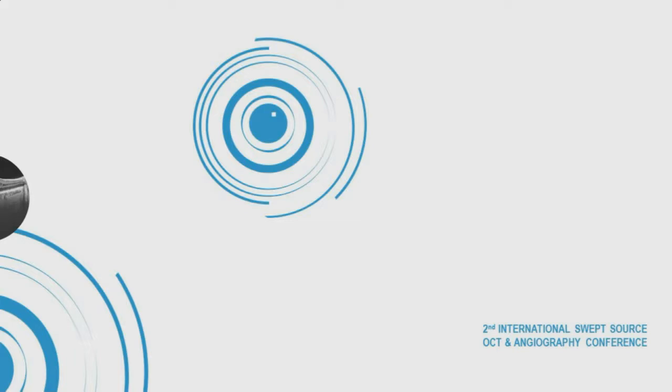Very interesting. As you showed me in New Orleans, I think, the RNFL pictures you're playing with. In glaucoma, we have a big group of patients. We reach the floor, and that's all. That's where OCT stops. What we are measuring is the thickness of the RNFL. It looks a little bit primitive now with all these pictures. Are you doing something for that? At that floor effect, can you still count some RNFL that's hiding inside the structures?